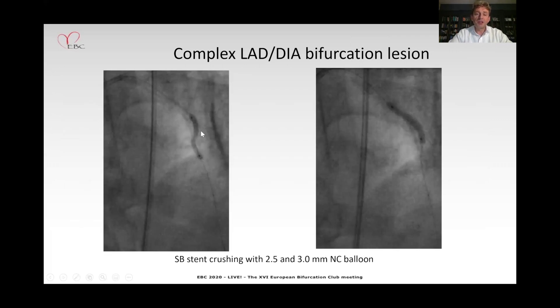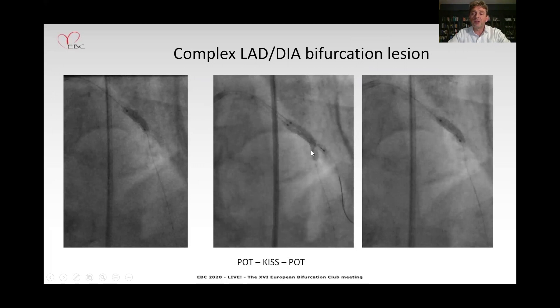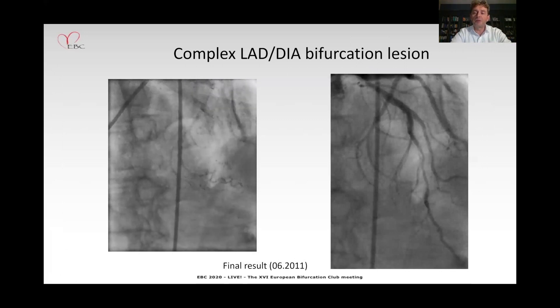I pre-dilated the mid portion of the vessel with a 2.0mm balloon, then crushed the protruding Triton stent in the main vessel with a 2.5mm and then a 3.0mm balloon. Finally, I managed to position two stents: the first distally to the bifurcation and a proximal 3.0mm long stent in the proximal-mid portion of the LAD, with POT, kissing, and final POT. The result was perhaps suboptimal, especially for the mid LAD, but TIMI 3 flow was restored to the vessel and the patient was safe.